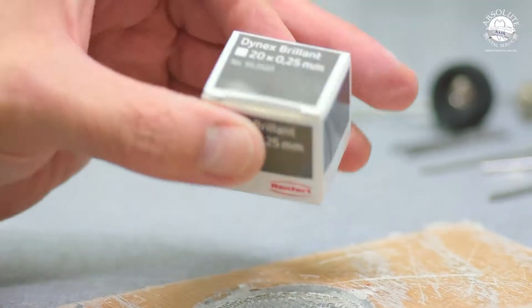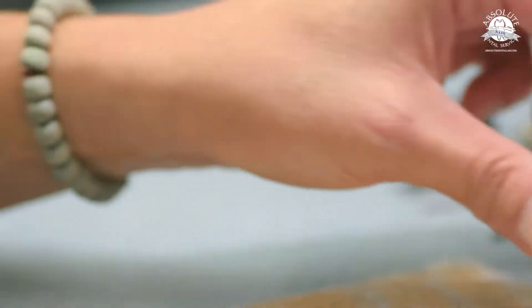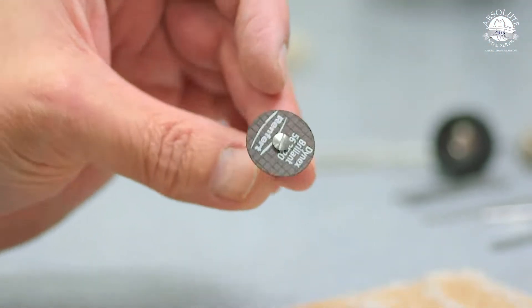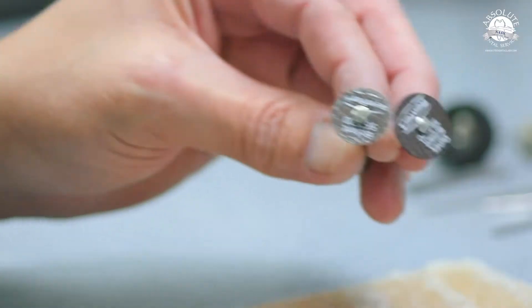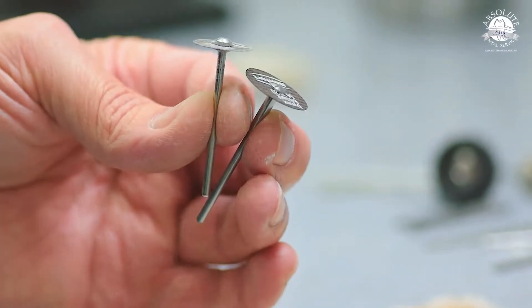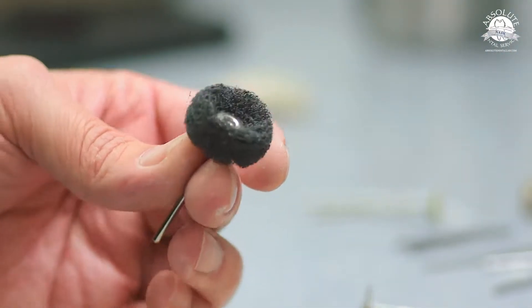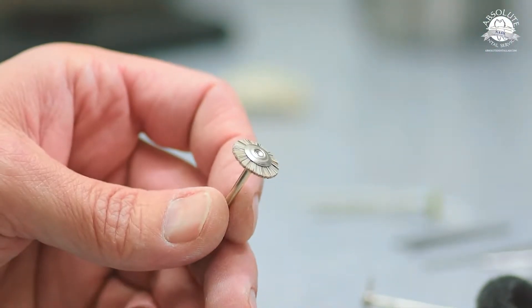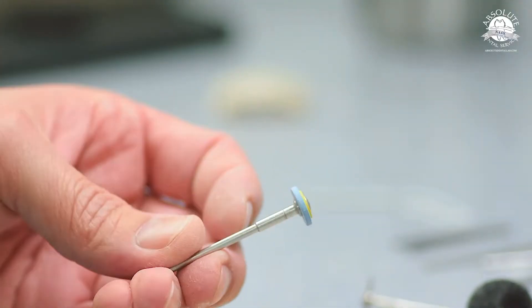First, we're just going to talk about some of the tools and instruments I use for green stage finishing. I've been using Renfer Brilliant discs forever — they are amazing. They cut really true, they're really nice, and they keep cutting as they get smaller. So normally I'll have a couple of those mounted up. This is a Brassler Scotch-Brite, a number nine short bristle brush, and dialyte rubber wheels.